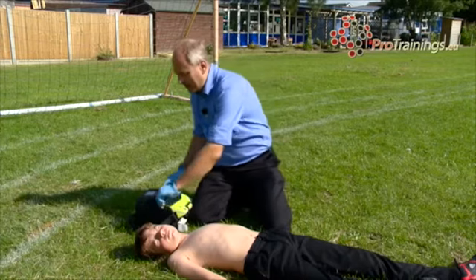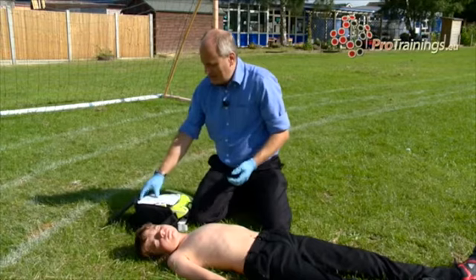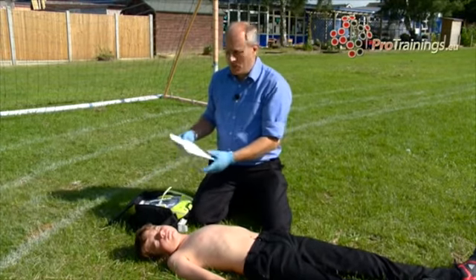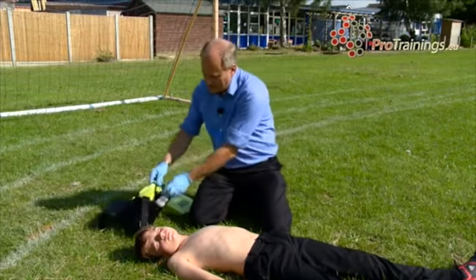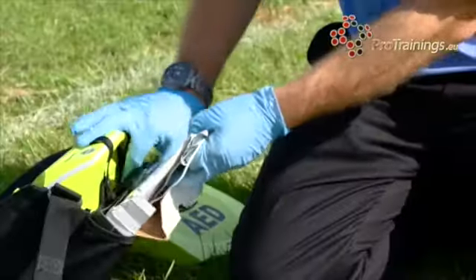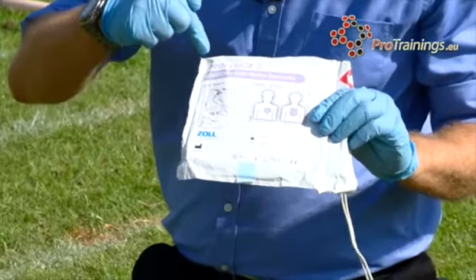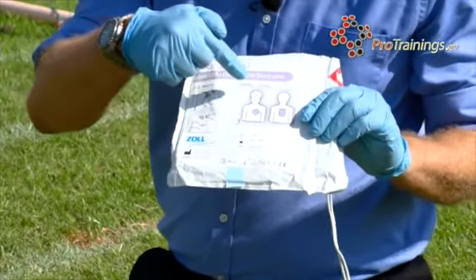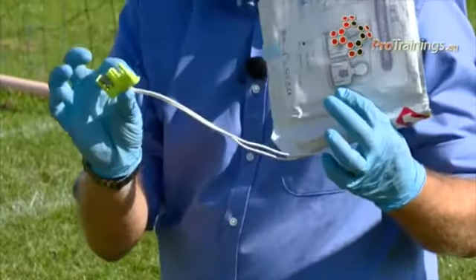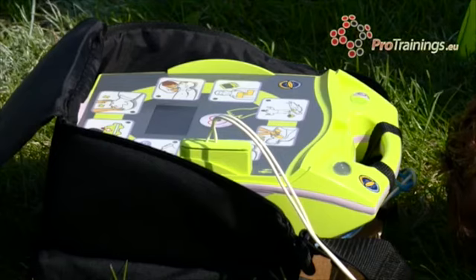But when we open up this unit, it's standard, got adult pads inside it. So what we need to do is remove these pads and then get out the child pads. You can identify child pads because they'll always say on it, here it's a pediatric pad. It will also show pictures of exactly where the pads are going. The actual plugs are the same, it just plugs straight into the unit. And also the unit will tell you that we're getting pediatric pads in there.